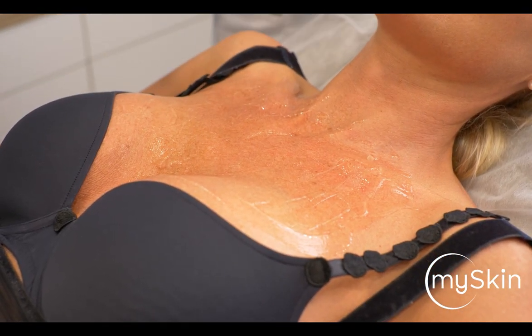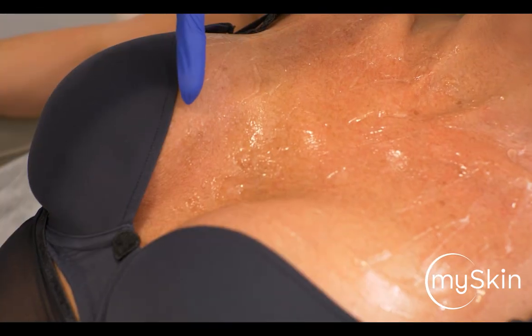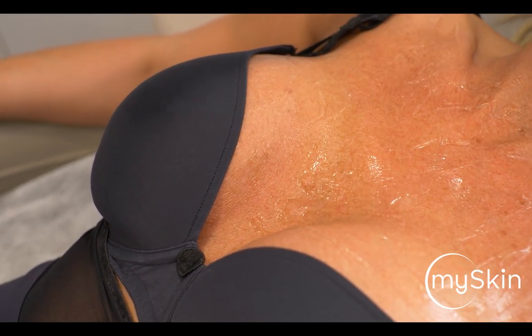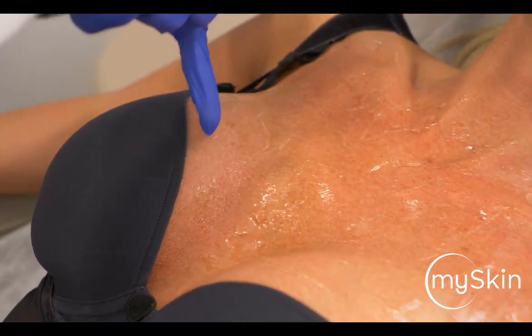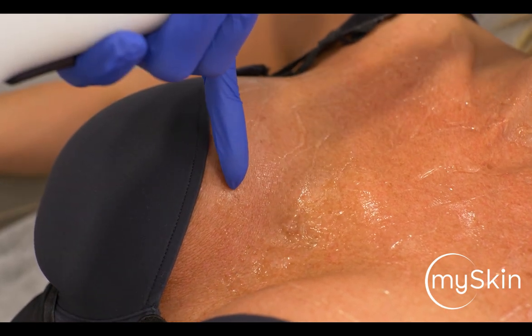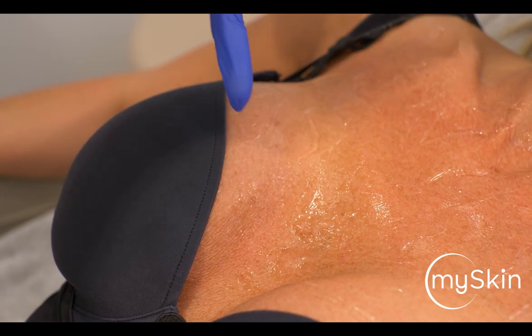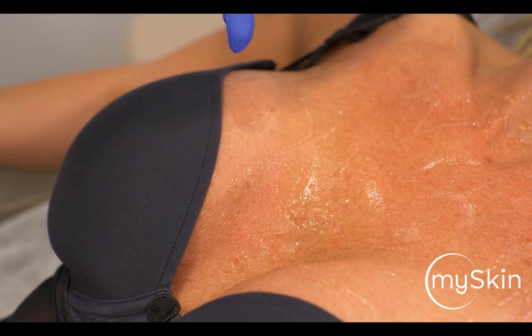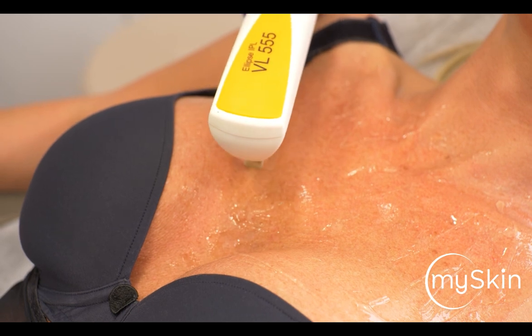Here we are. I watch the reaction of the skin, and we can see a clear change of color on the lentigo — this is exactly what we are expecting from the treatment. After about two minutes, you can clearly see this is an untreated lentigo here and this is the treated one. We see clearly the oxidation process of the lentigo, and this is our endpoint — exactly what we would like to reach without too much redness around it. I feel comfortable with this setting.